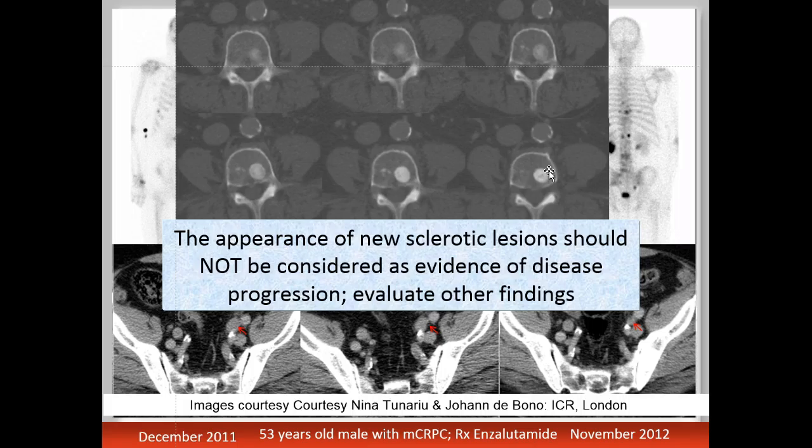New disease, or is this due to healing? Well, clearly there was a lesion there before. It's just well marginated. It's dense. This is in fact healing. So you can see how this lesion, which was reported as progression, in fact represents healing.